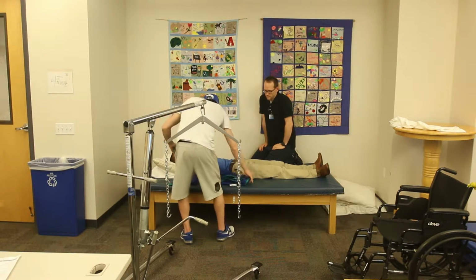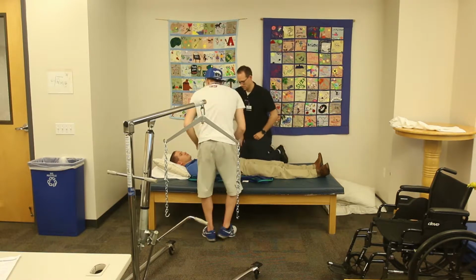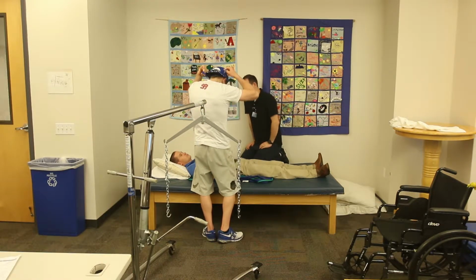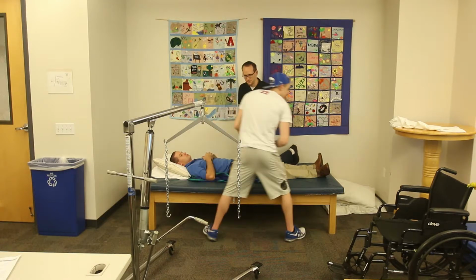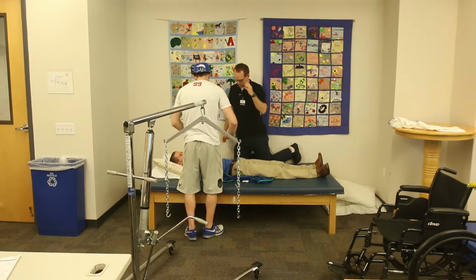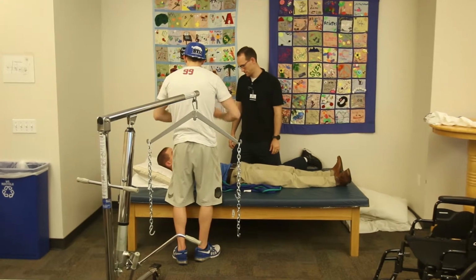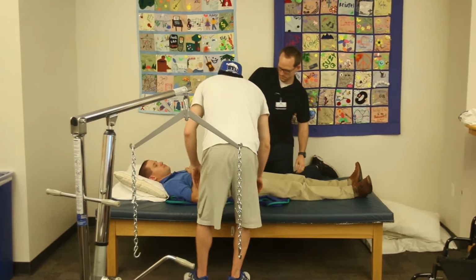Untwist it here. Okay. How this is going to work is we're first going to roll you over, get my name tag out of the way so it's not hitting you in the face. We're going to roll you towards Lucas. Then we're going to push that underneath, and then we're going to roll you back to here, and then roll you back towards me, and push all the way back underneath to get you situated.